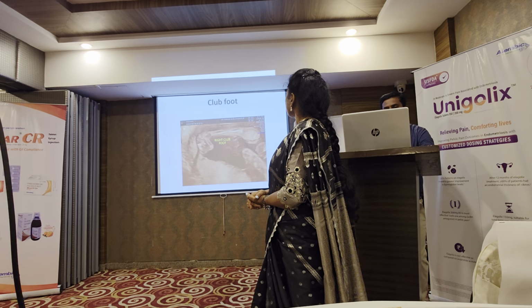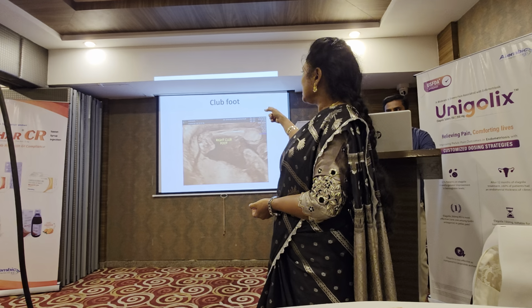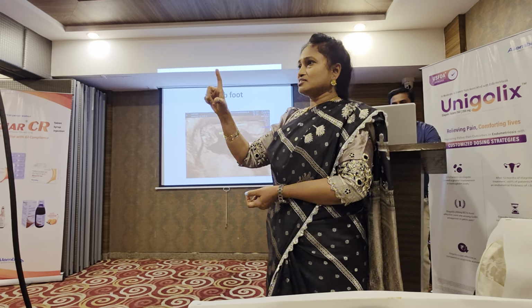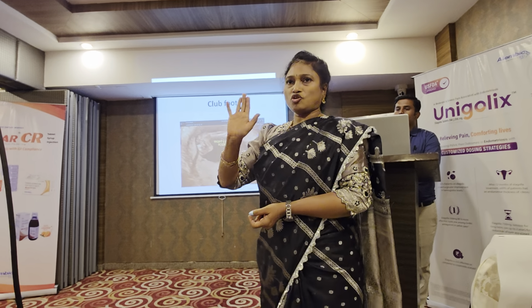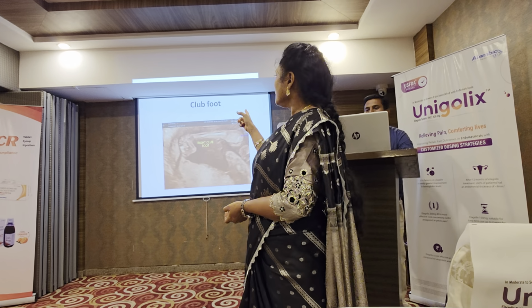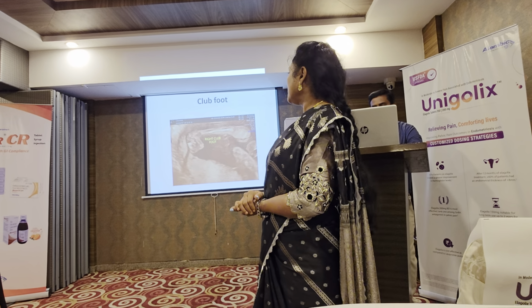Next one. So this is the club foot. In this you can easily make out, because that foot sticks out. When you make a scan, you can easily see that this foot is not normal. Instead of this way, it is sticking out. It has a different angle. It sticks out. It's easy to diagnose if you are looking for it, it's very easy.